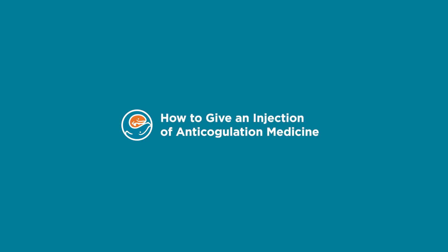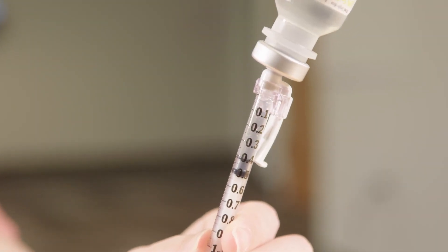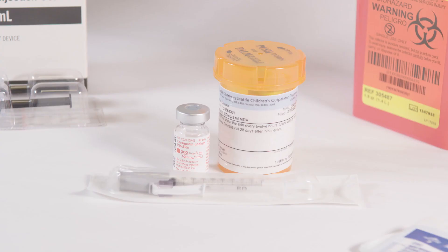This video will teach you how to give an injection of anticoagulation medicine. This medicine is given subcutaneously, which means it is given into the fatty layer of tissue just below the skin.